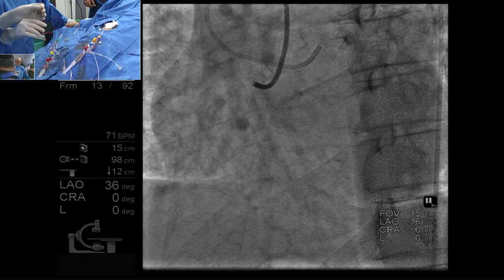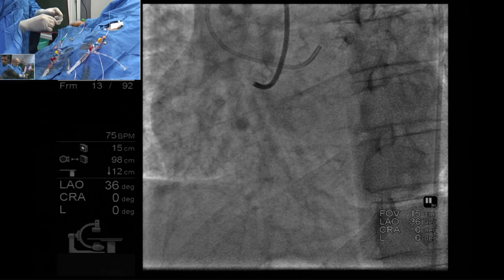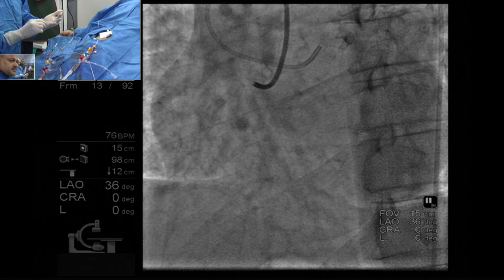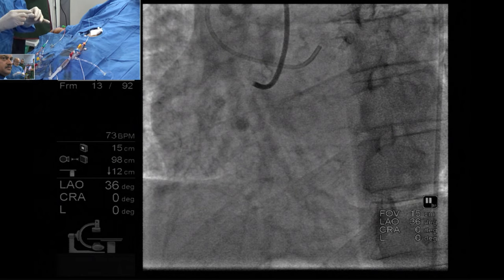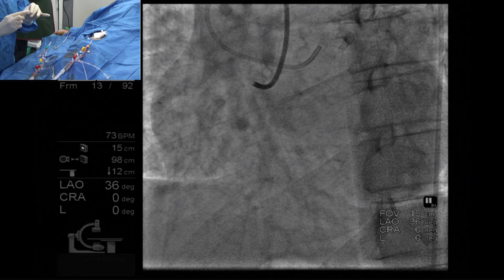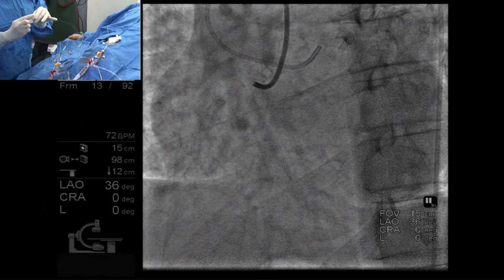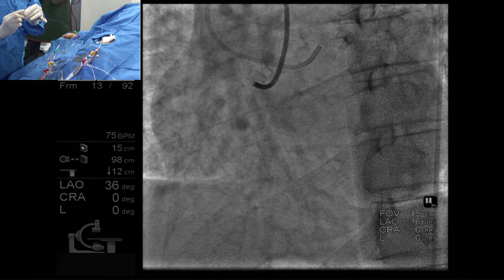So Tejas, just outline your strategy. Are you going to take a microcatheter from the beginning down to the proximal cap? Yes. And one of the things when we assess these CTOs is that the distal cap reconstitution is right at a bifurcation. So there is some risk of losing one of those side branches at the distal bifurcation. Are you going to pick the most important branch? Seems like the PDA is the bigger branch. Yeah. It will depend on opening up the vessel. After opening, we can tell whether any branch will be depressed or not.